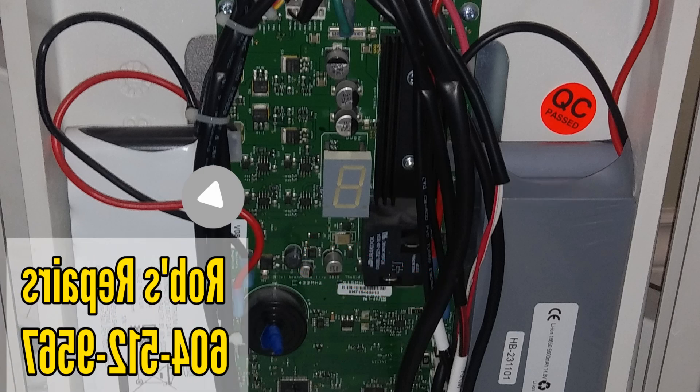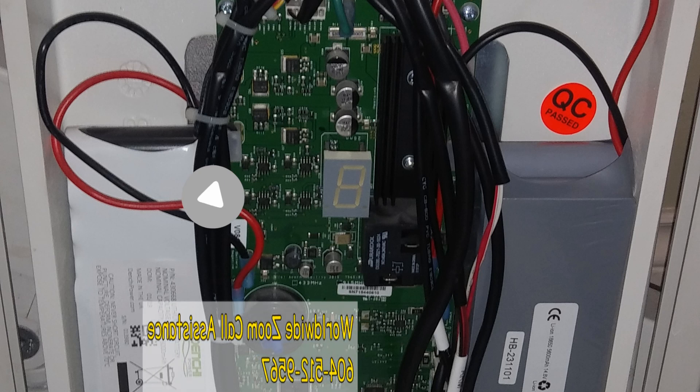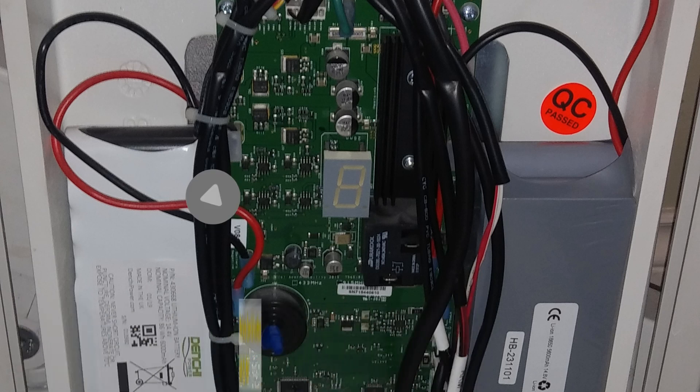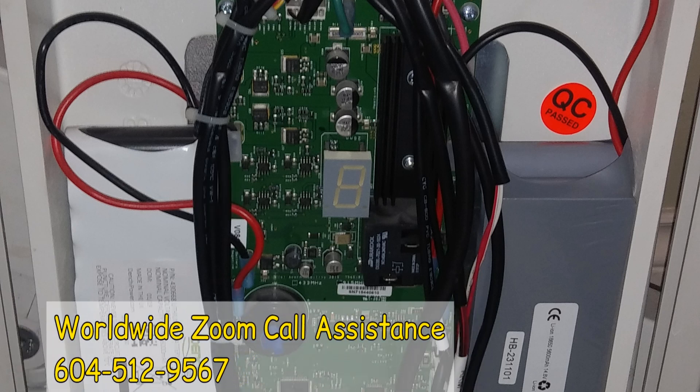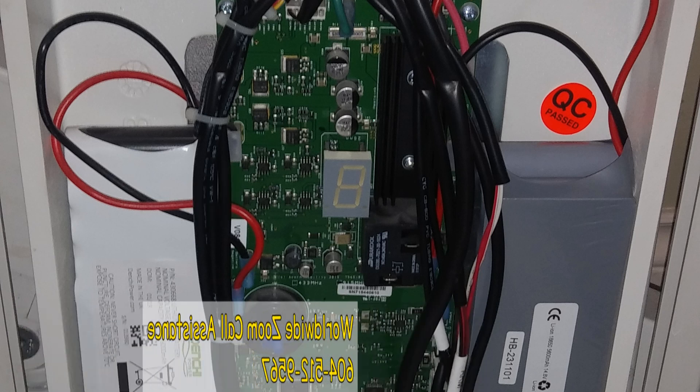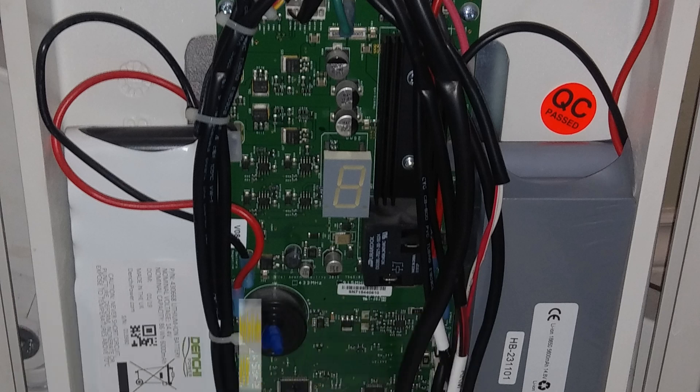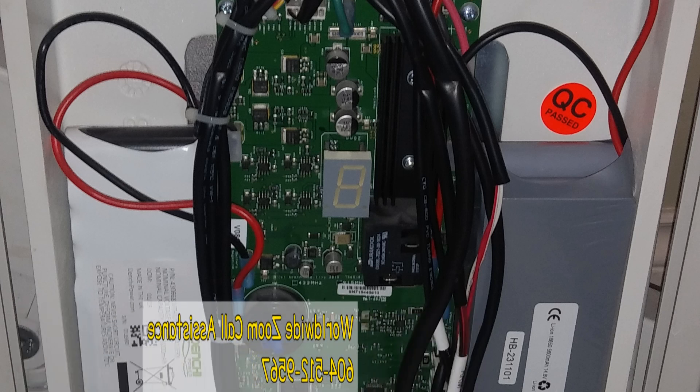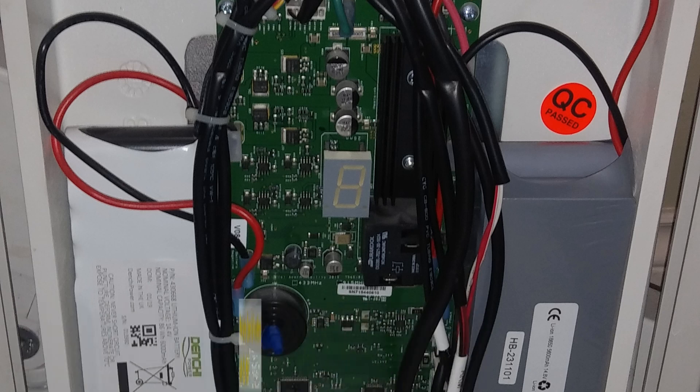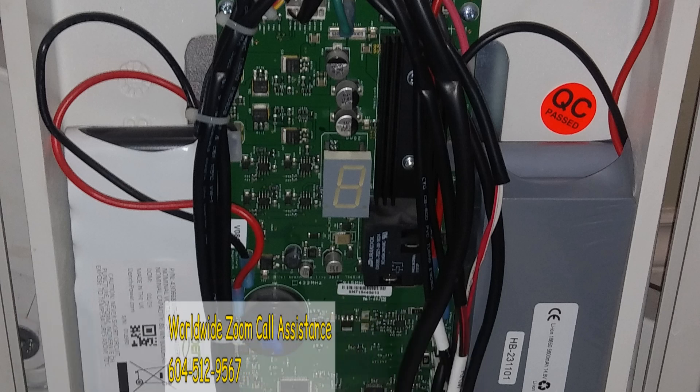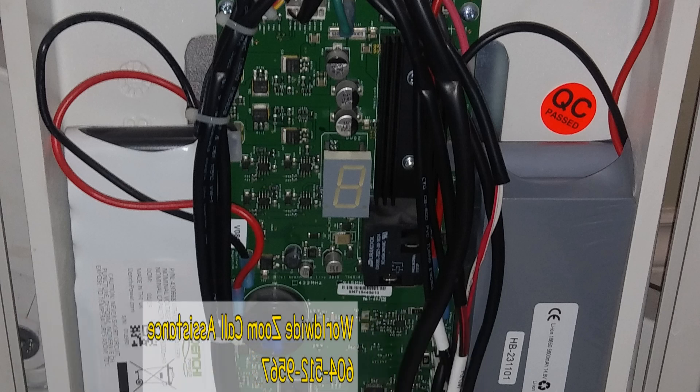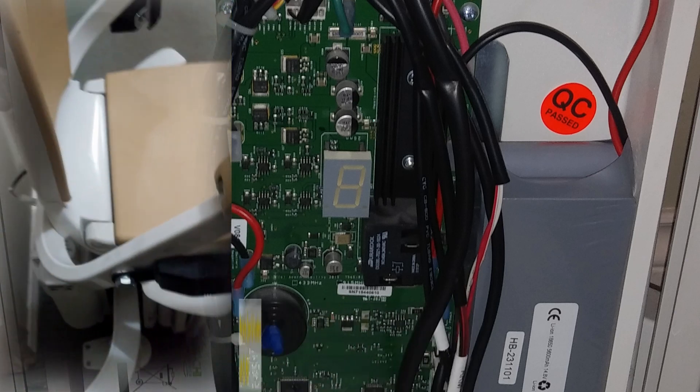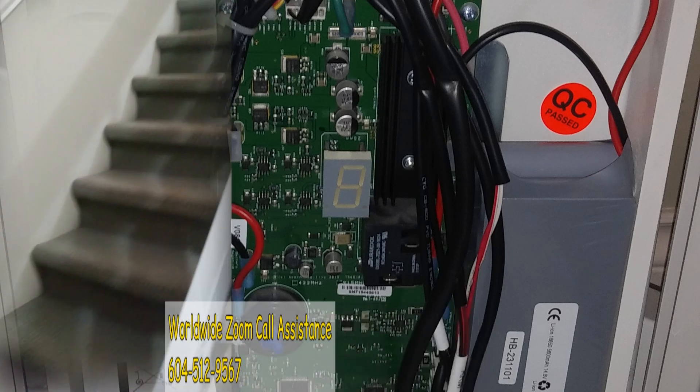There are many models of this particular stairlift that is labeled as a 180. And depending on the model, the reprogramming or programming after a battery swap takes different steps.